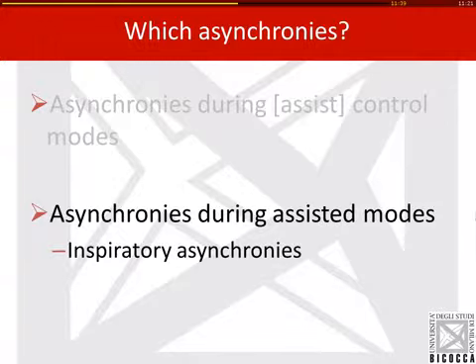And so, in the last 10 minutes, I would move to the last and maybe more tricky aspect of the asynchronies, which are the asynchronies occurring in those fully spontaneous assisted modes, of which pressure support is the most common, and also data show it is the most used.